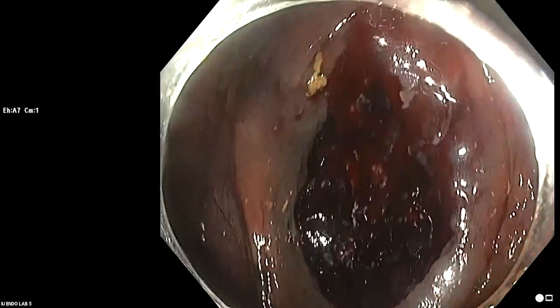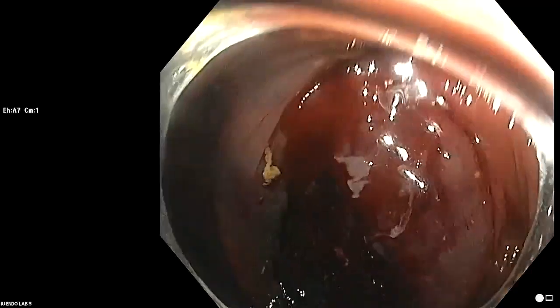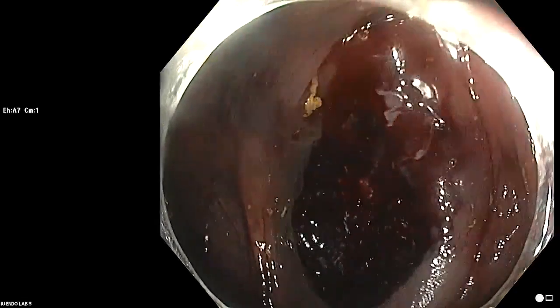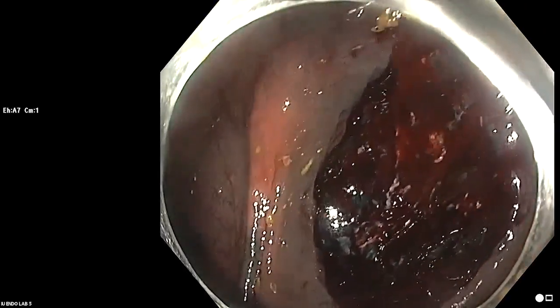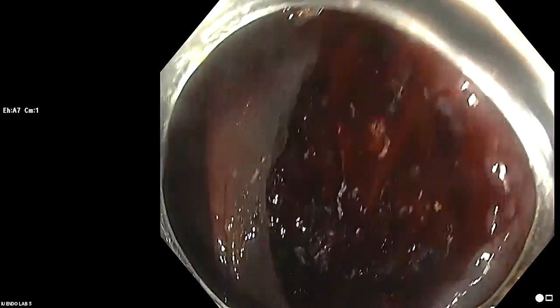Hey, Doug, some of the audience members are getting a little bit concerned about the clot and some oozing and stuff like that. Do you ever clip this at all? No, the only way I would clip this is if I saw steady rapid streaming. Very rarely you'll get an arterial bleed. So this ooze right now, you're okay with it? You're going to go home and you'll be fine? Yeah, absolutely.